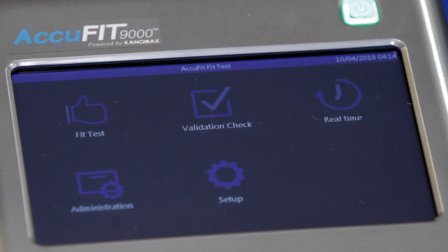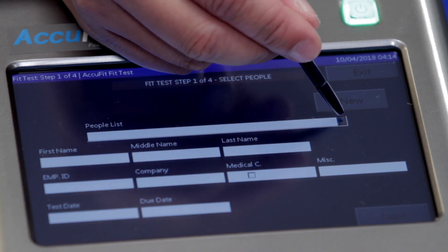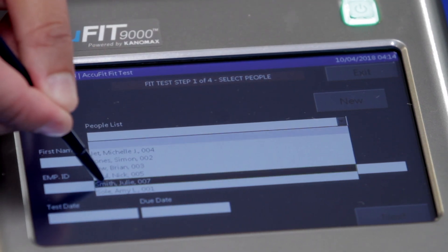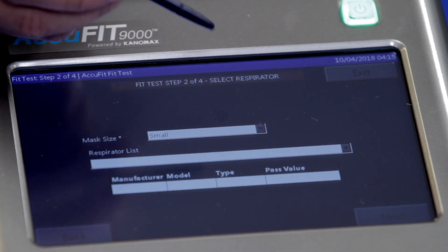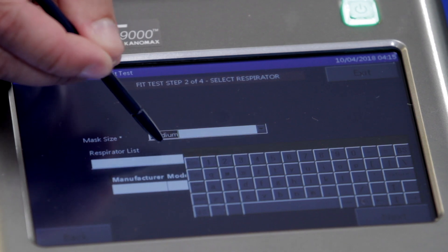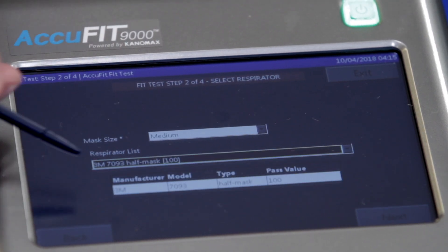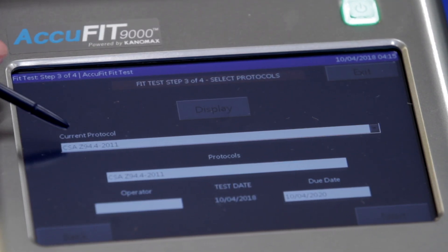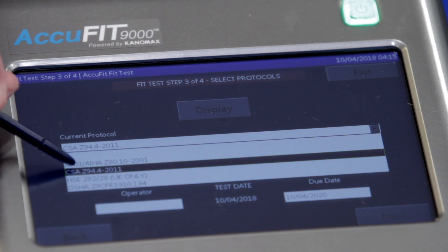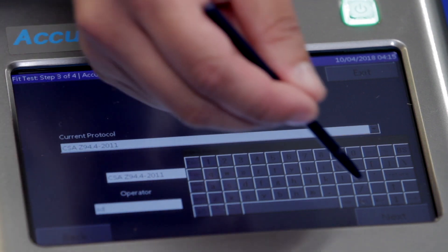To begin the fit test, tap Fit Test from the Activity menu. Select the individual's name from the pull-down menu and tap Next. New names can be added by tapping the New button that allows their data to be entered. The next step is to choose the respirator. Select the respirator make, model, and size from the drop-down menu and tap Next.